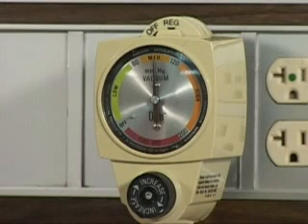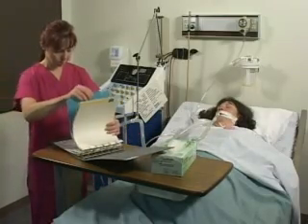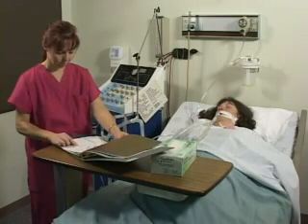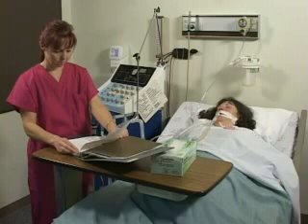Check the setting for the suction device used for this suctioning. It should be set at -80 to -120 millimeters mercury. Prior to suctioning any client, conduct a baseline assessment for comparison during and after the procedure. Review the client's previous arterial blood gases and oxygen saturation values when available. Evaluate the client's ability to cough and voluntarily deep breathe. This will help the secretions to clear from the lungs as well as increase the tidal volume during the suctioning process.